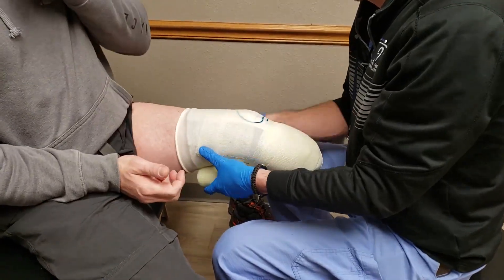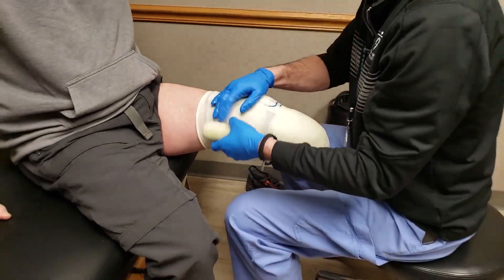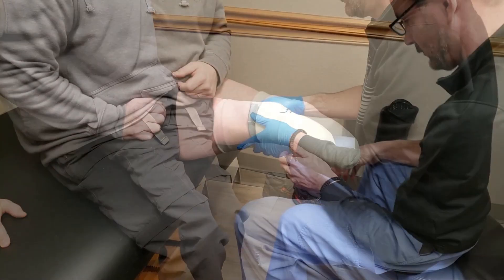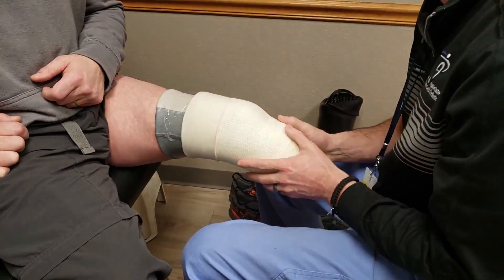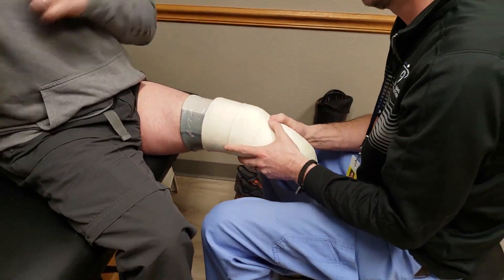Once the prosthetic liner is applied and bony points are marked and measurements have been taken, a circumferential wrap with fiberglass is used to solidify the shape and capture the contours that the prosthetist is attempting to incorporate into the prosthetic device.